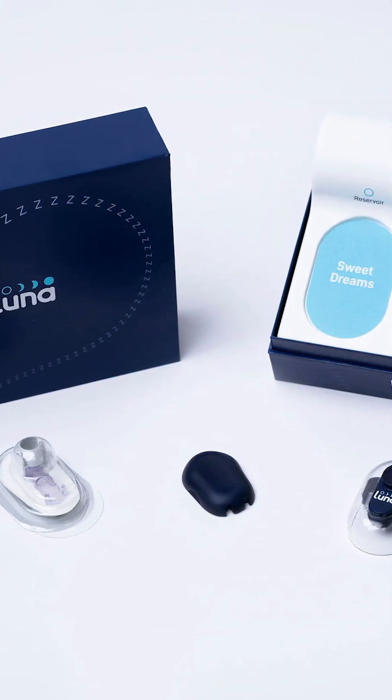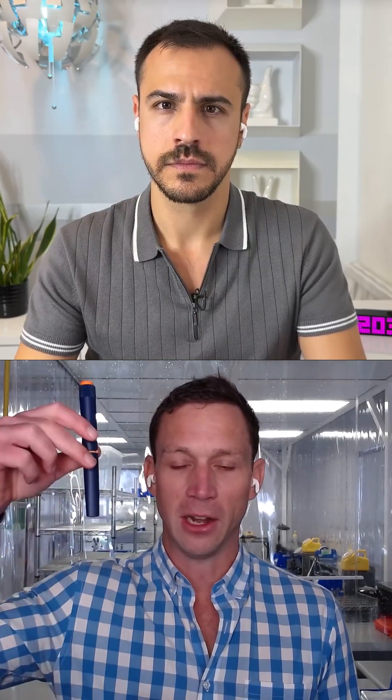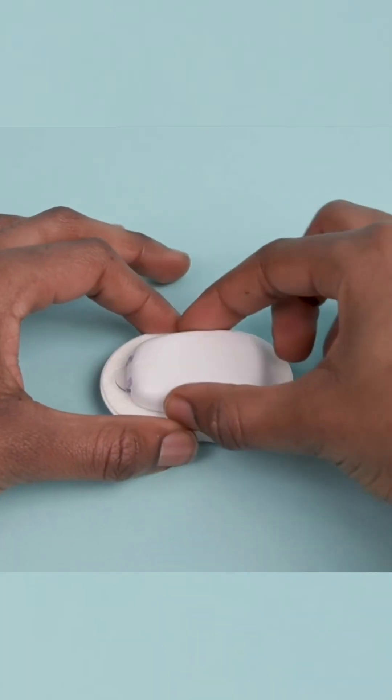Walk me through that step by step of putting it on. Use your own rapid-acting insulin pen that you used for dinner. Fill it into our reservoir — dial between 1 and 10 units of insulin and fill it up — then attach the pump to it, lift it up, and put it on your body.